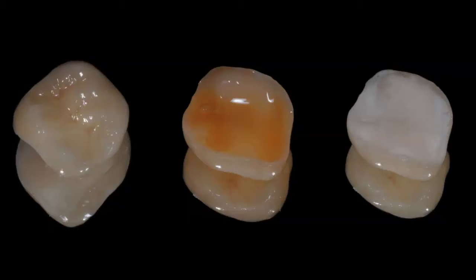So step number one, I'm going to try in the restoration, make sure that I'm happy with the way it sits and with the interproximal contacts. And once I'm ready to deliver the restoration, I'm going to move forward with the hydrofluoric acid etching of this restoration.